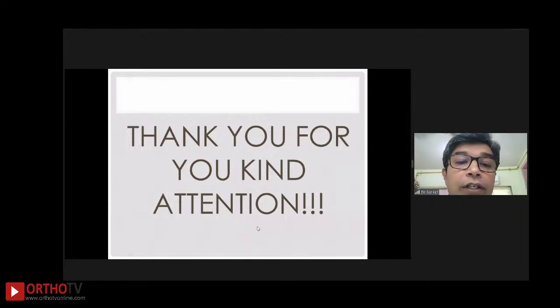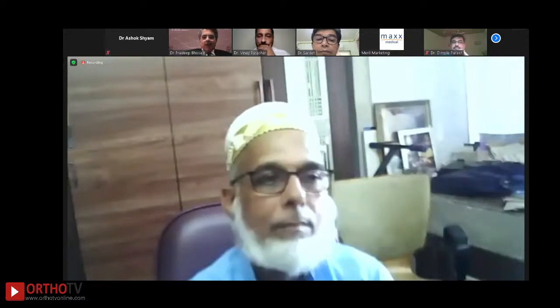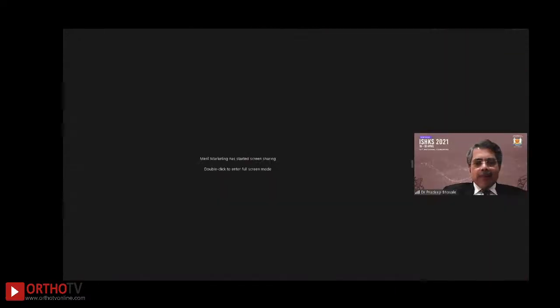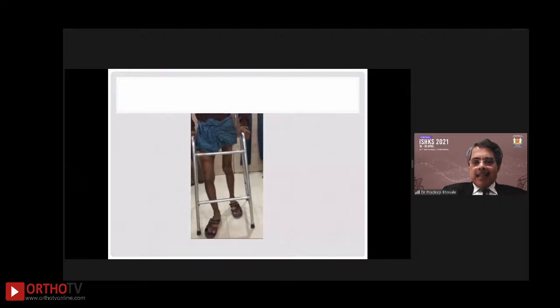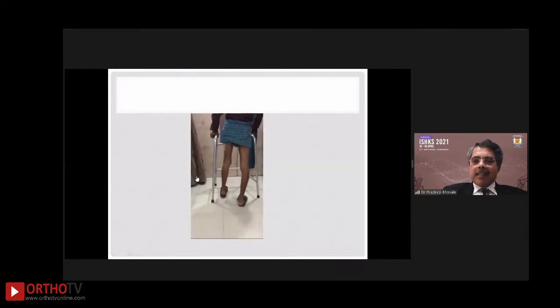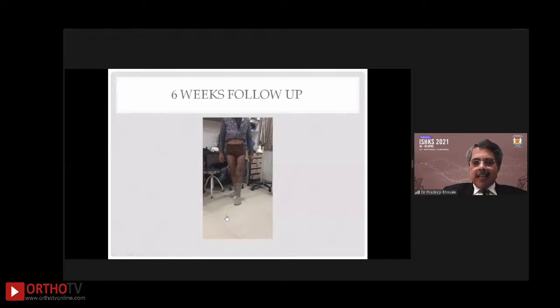Nice. There is a question from the audience: how much lateralized should the cup be placed from the teardrop in case of protrusio or normal primary THR? The teardrop is a very good indicator, an anatomical landmark for the cup. Even in lateral supine position, the teardrop is the best landmark for putting the cup anatomically. Now, there are two things: one is cup version, and second is inclination. For version, the plane of the socket should be parallel to the teardrop. For 45 degree inclination, the socket should be just inside, medial to the teardrop. If it is more medial, it may be less than 45 degree. But for 45 degree, it has to be just medial to the teardrop. If it is outside the teardrop, you can say for sure the inclination is more than 45 degree.